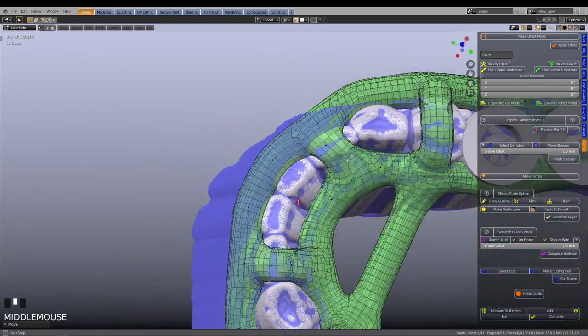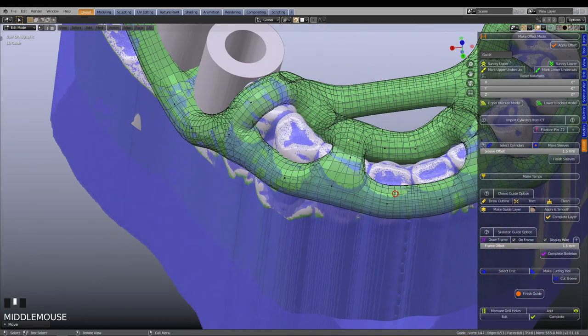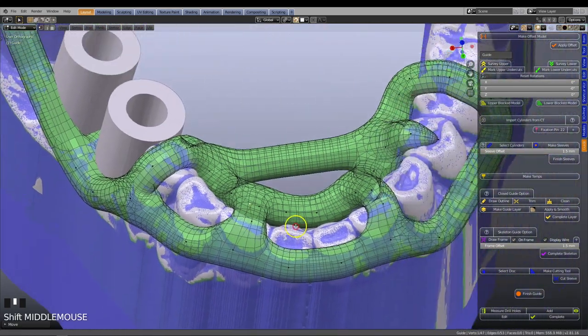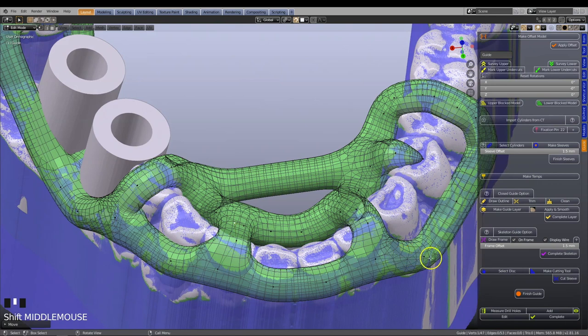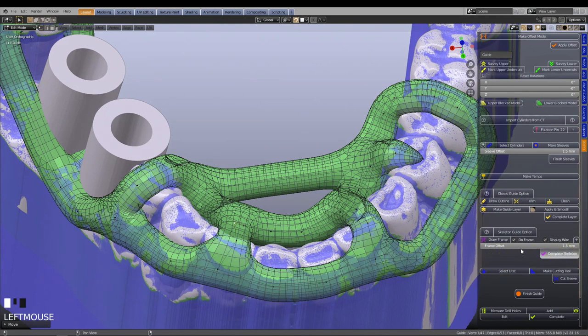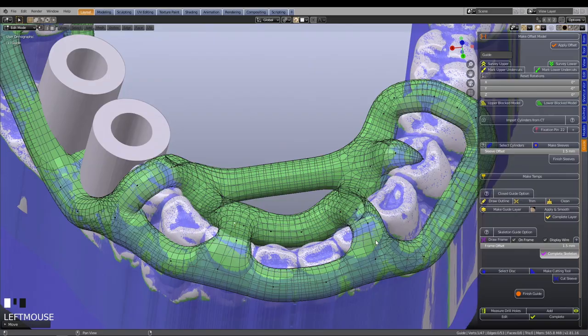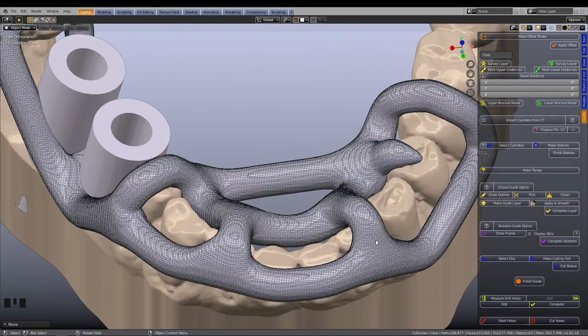After this, we can solidify the guide. Navigate back to the menu and press on the complete skeleton tab. This action will remesh the entire structure into a brand new mesh.